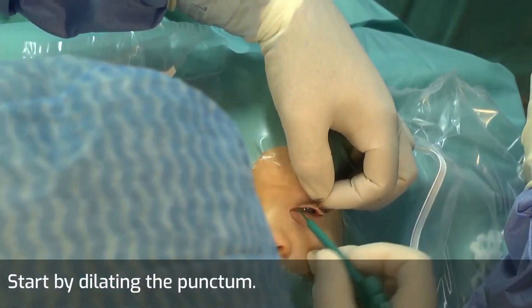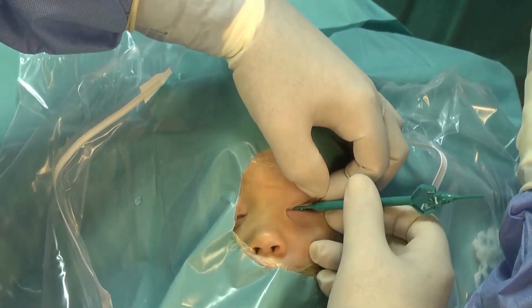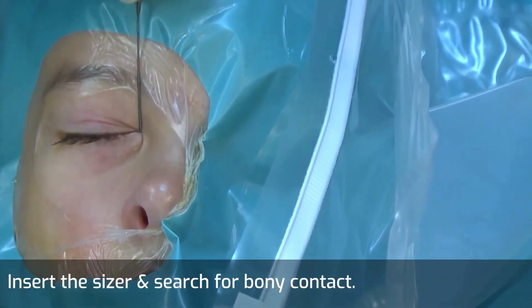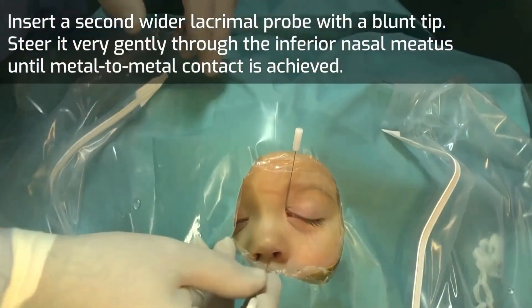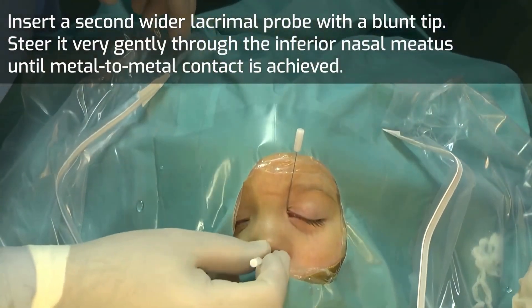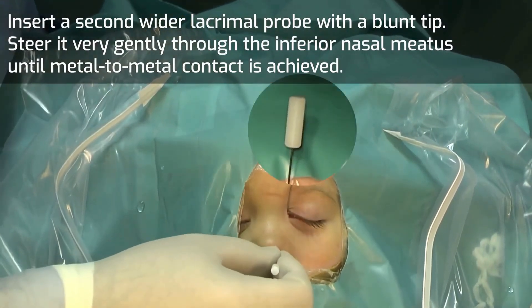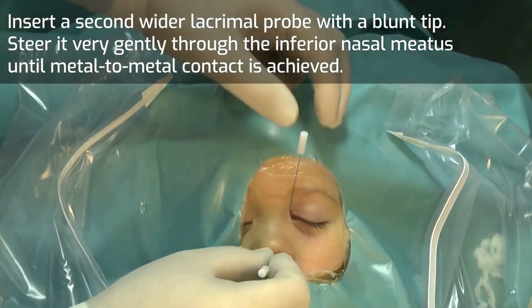Start by dilating the punctum and insert the sizer. Search for bony contact, then perform a 90-degree rotation and vertical catheterization. Insert a second wider lacrimal probe with a blunt tip and steer it very gently through the inferior nasal meatus until metal-to-metal contact is achieved.